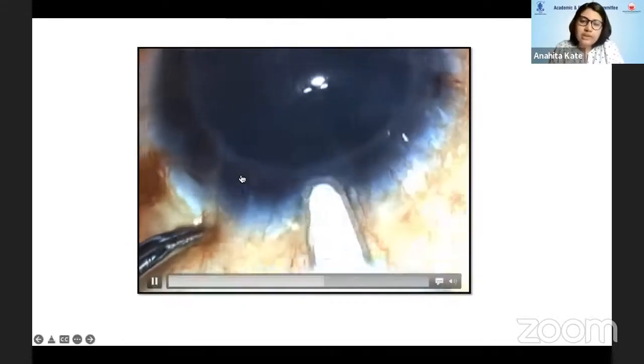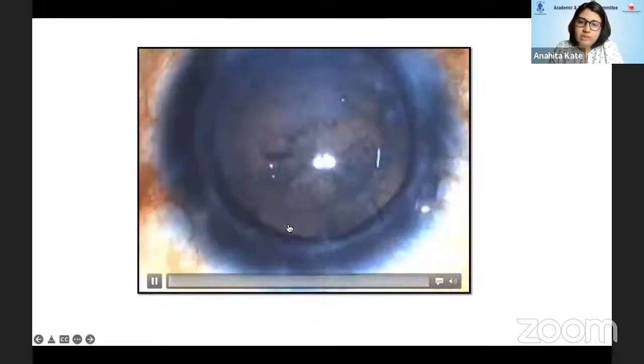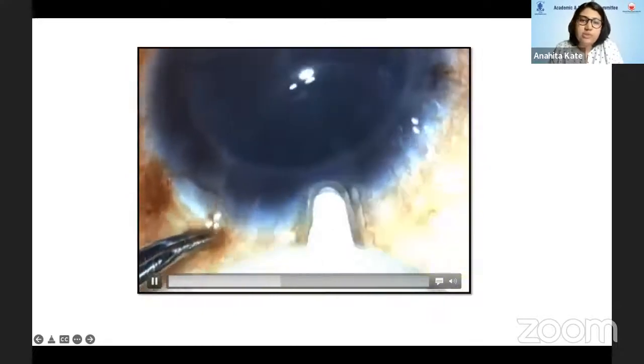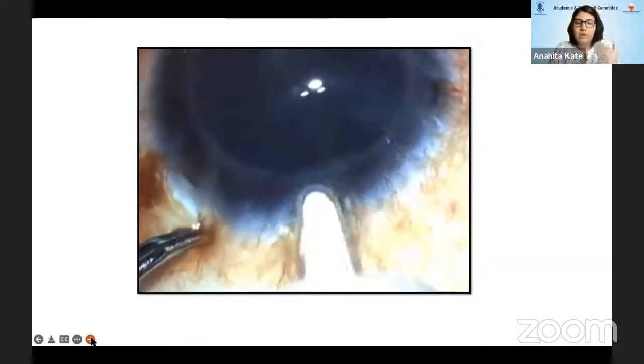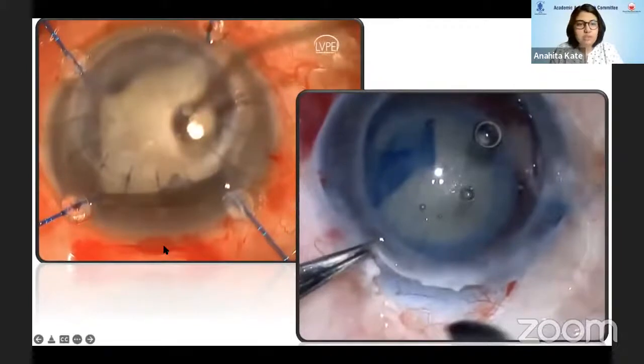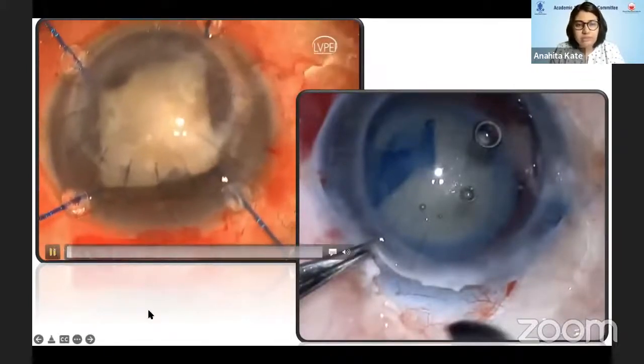Another good idea, as can be seen in this video, is that the internal lip can be widened a little so that there is no undue stress on the Descemet's layer. This concept of not touching the graft host junction applies not only to the main wound, but also to the side wound, side ports, and all other incisions made, such as that for iris hooks. None of them must touch the graft host junction.